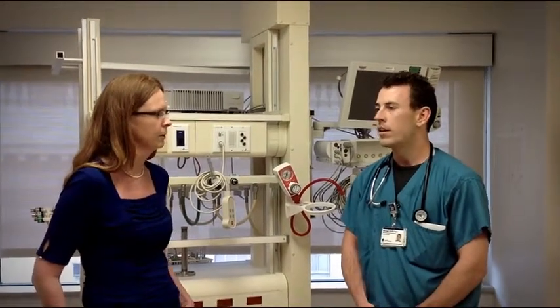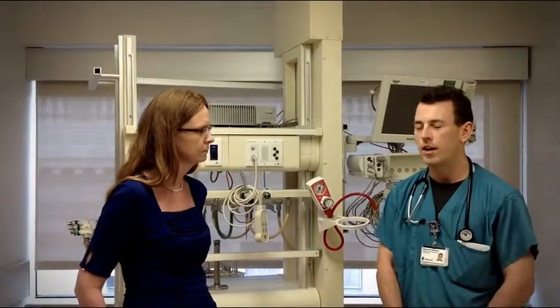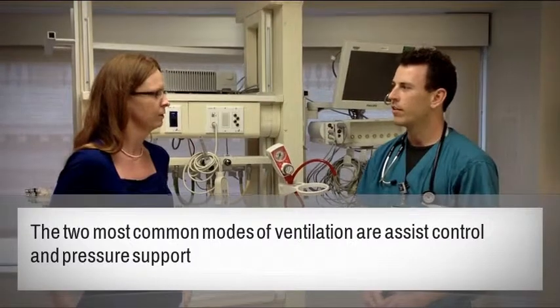What about an NG tube or a Dobhoff? Does that preclude using BiPAP? That is one of the main causes of leaks with that tube. There's no real way to avoid that at all, so you have to compensate by increasing the IPAP to help get them more volume. If he is intubated, what are the common modes that we use for ventilating them?